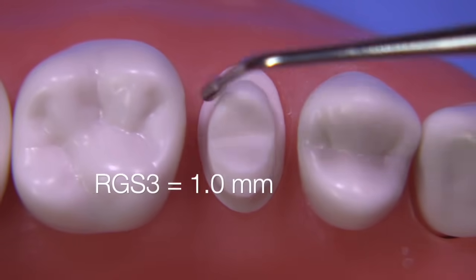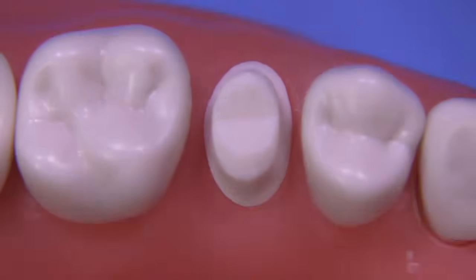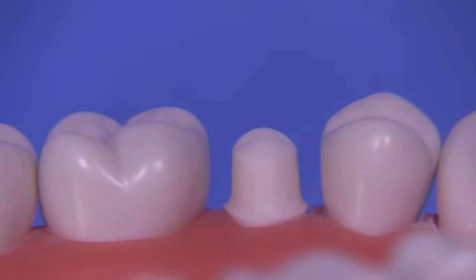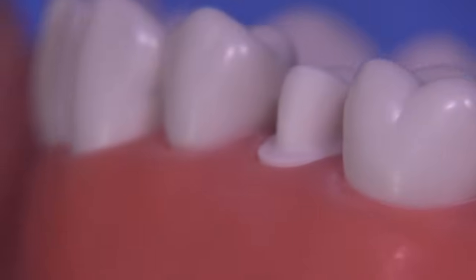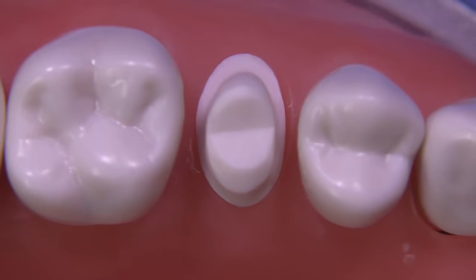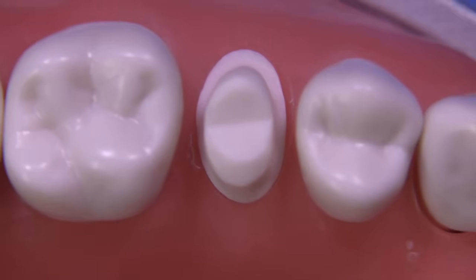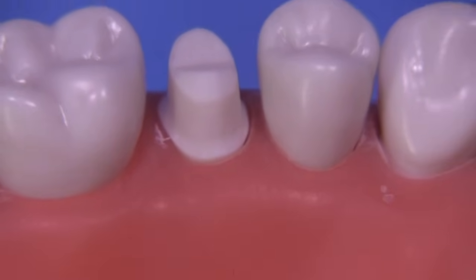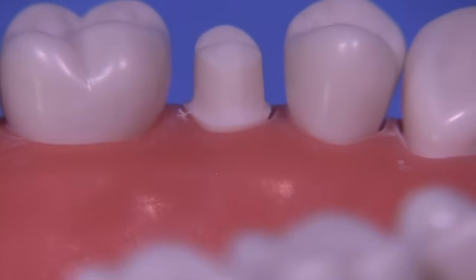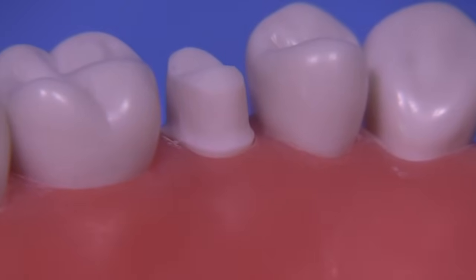We can measure now with the RGS3, which is one millimeter, and see that we have approximately one millimeter of facial shoulder — a little bit more maybe — and a chamfer design on the lingual. The technique seems to work pretty well, and I've used it clinically many times. I thought it would be good to share — I hope you enjoyed the T-prep design. I'm going to apply this to other preparations; you can basically do it on anterior teeth, posterior teeth, virtually any preparation for crowns or bridges. Thank you so much for watching and I hope you try the T technique — all the best.